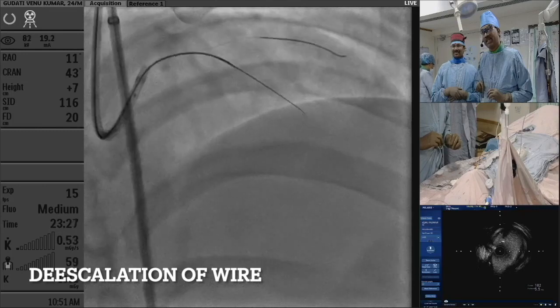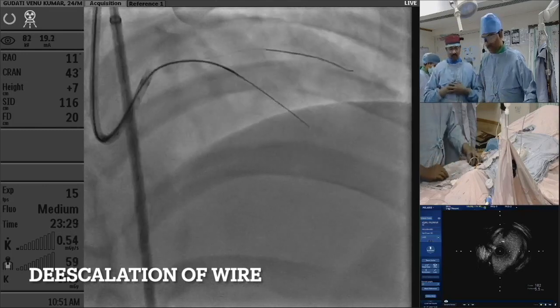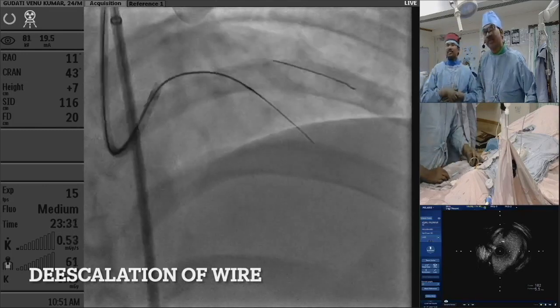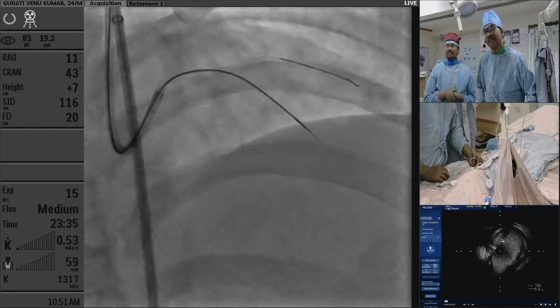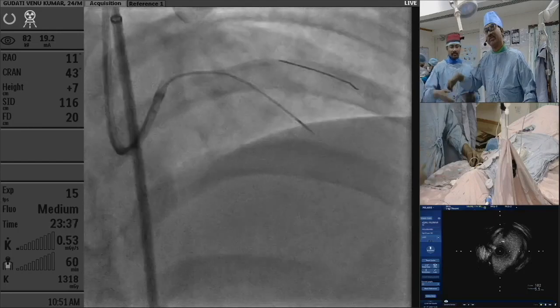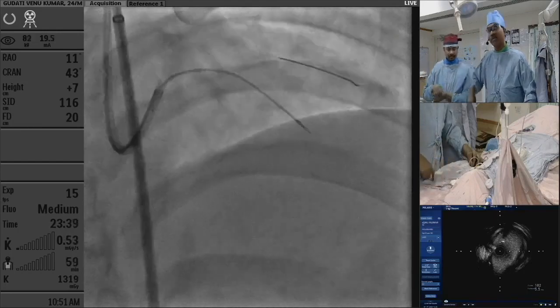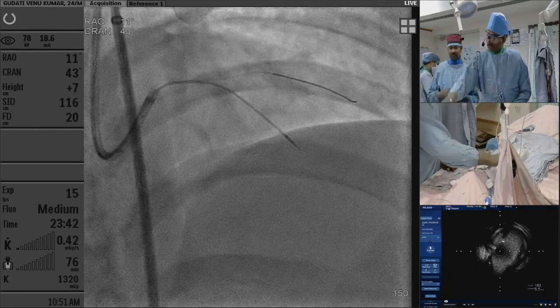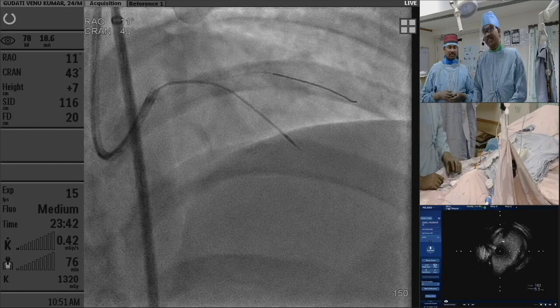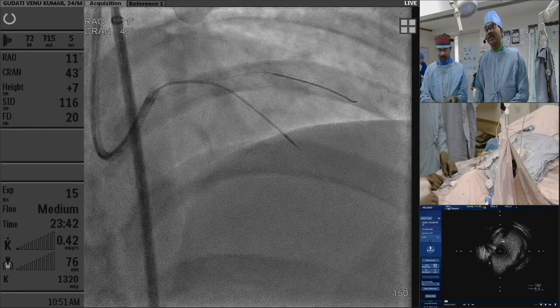See here, the challenge is, give me a workhorse wire. Or Renato, better Renato. So that's an advantage. So with the escalation, de-escalation, had we continued with the same Hornet, it would have gone suboptimal.